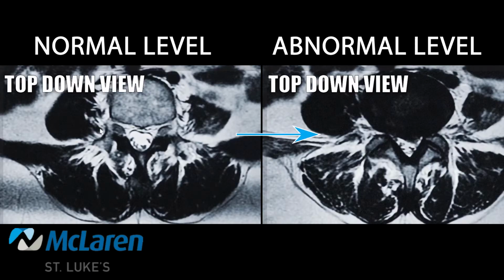Now these are the slices of the lower back looking at the level where the herniated disc is. So if you look here on this particular slice, you can see there's a broad disc herniation represented by this dark material that's pushing into the spinal canal and also narrowing the space and pinching the nerves as they go out through their openings. And you can see the disc is more off to this side of the picture, which is the left side of your body.